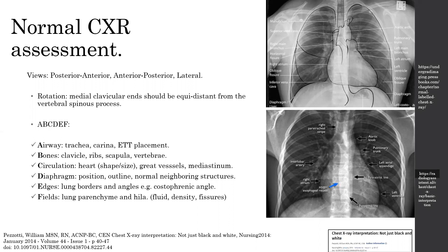There are different mnemonics and methods to assess the chest x-ray, but the ABCDEF mnemonic is a useful approach. A stands for airway, in which you assess the trachea for deviation or midline position, the carina at the level of T4 to T6, and endotracheal tube placement, which should be three to five centimeters above the carina.